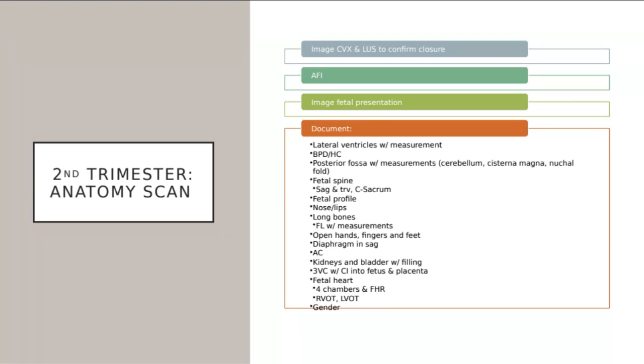And then we're taking a picture of our bladder. So we want to make sure that that baby's bladder is nice and full. Sometimes if it looks way too big, we want to wait for it to empty a little bit, and then we'll take another picture. Or if we don't see the bladder at all, we know that we need to wait a little bit to see if it will fill. Maybe we just missed it. It had just emptied and we just missed it.